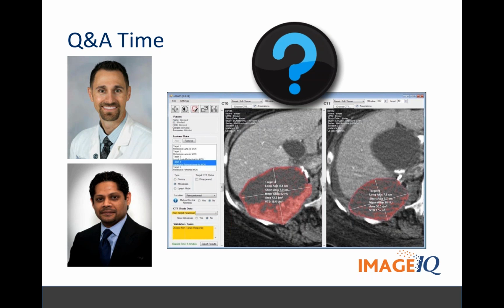Yep. Excellent, excellent. Okay, here's another interesting one. I'm not exactly sure where this one's going, but can you do near real-time analysis is the question. How does that work? Yeah, I like that question. I think what you're asking there is, you're running a clinical trial and you need an answer. Maybe the therapy depends upon that answer. So how would you get that?